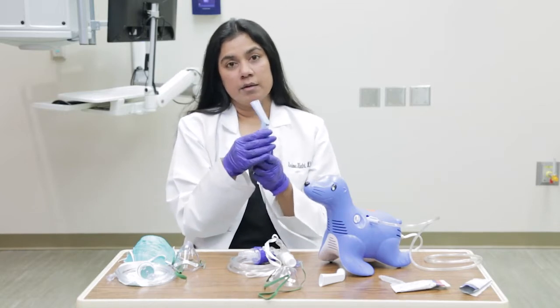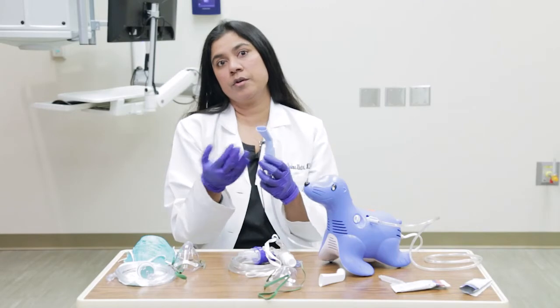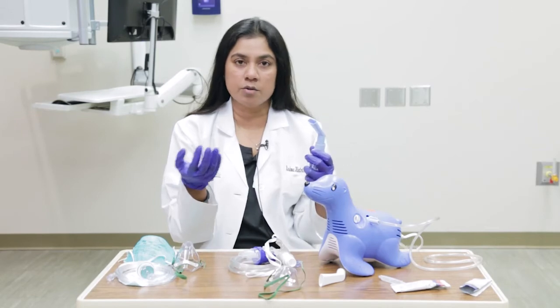Make sure that the child is taking deep breaths so that the medication goes all the way into the lungs. If your child seems to be frustrated or scared, just take two minutes and calm down yourself. If there is a way you can calm the child down — which could be watching a movie, listening to music, or maybe getting their favorite book — try that. For kids who are more nervous, you might even want to put the mask on your face or on a teddy bear to show them there's nothing to be worried about.